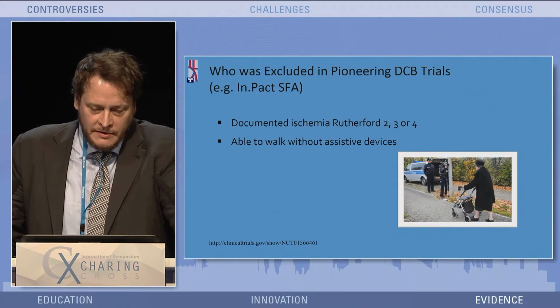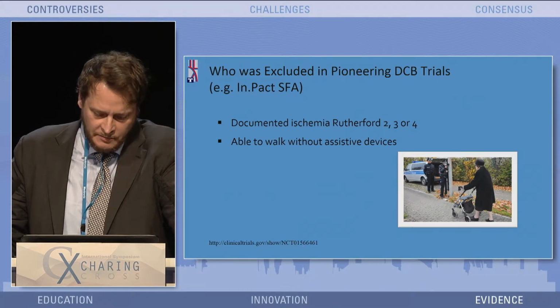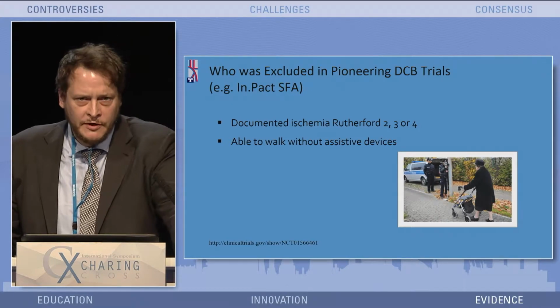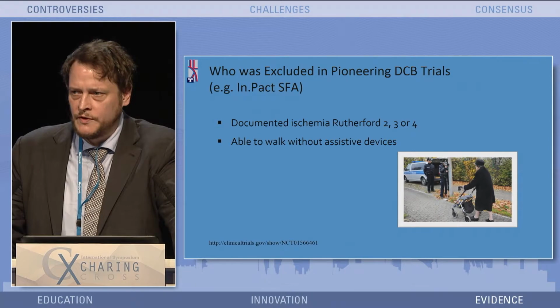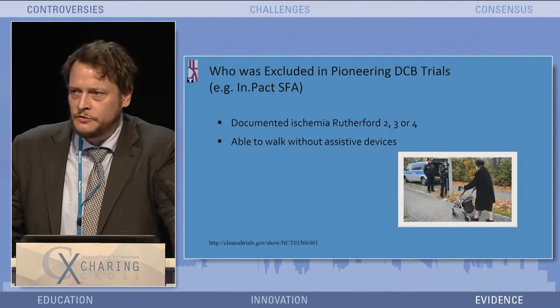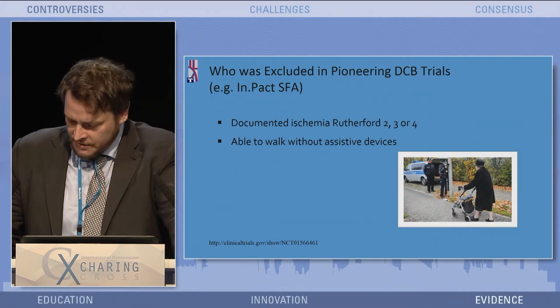that. Like, this is a first-line therapy for SFA disease, and Mencken, a publicist from San Francisco, said like 100 years ago, to every complex problem there's a simple and neat answer that is always wrong. So I think we need a differentiated approach to what kind of lesion we treat. And there is not one answer for everything.